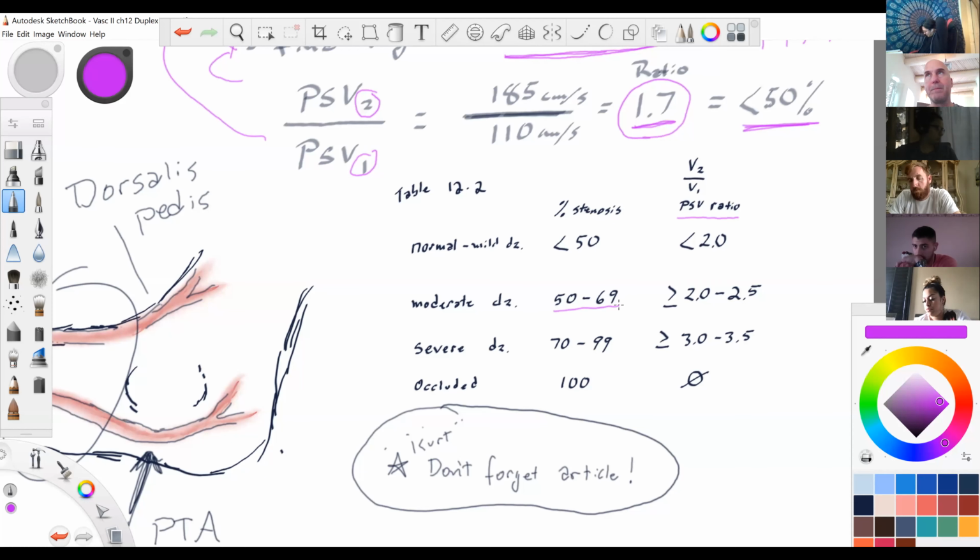Remember in the carotid, we can measure the stenosis, like literally putting our calipers and trying to measure the stenosis, but it's actually harder than it looks. There could be more or less residual lumen than we think we're seeing, but the velocities don't lie if you do them correctly. So that's kind of the gold standard, is the velocity, the spectral.